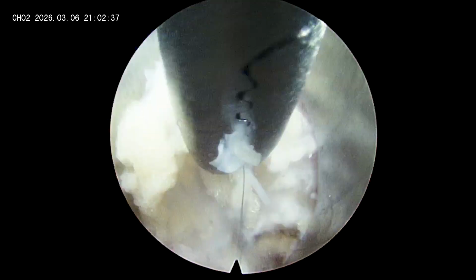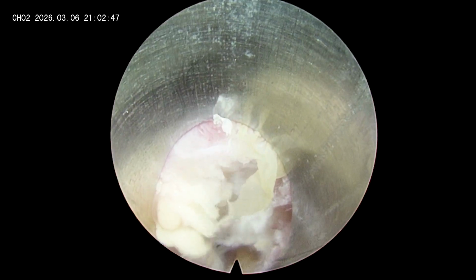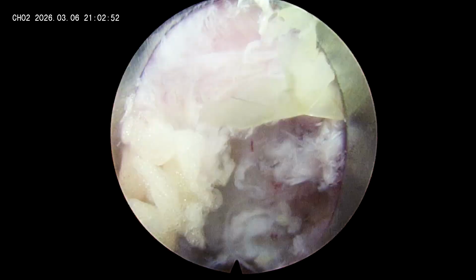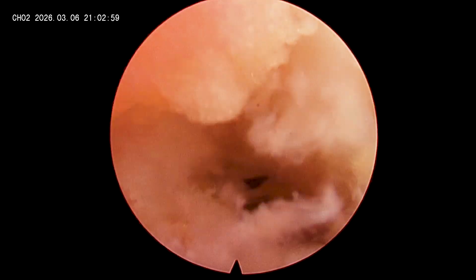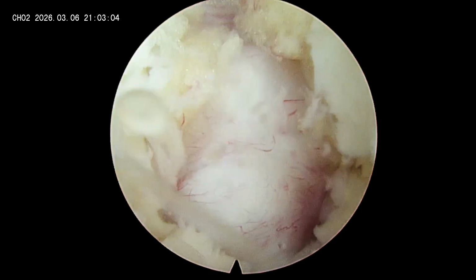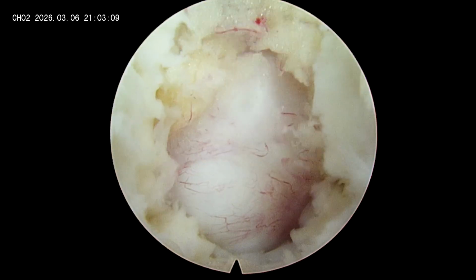So this usually happens. What you can see here is nothing but the plastic from the drape. So it is always advisable, before taking an incision, to remove some part of this plastic from the surgical site. If you keep it inside unintentionally, it may cause infection. This is a common complication which happens during surgery, and we have to take care of it.